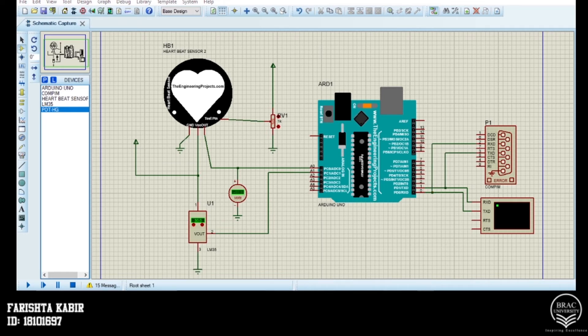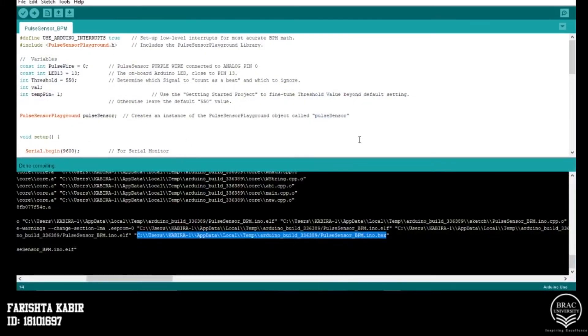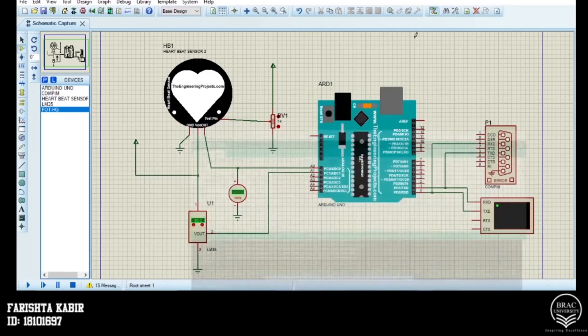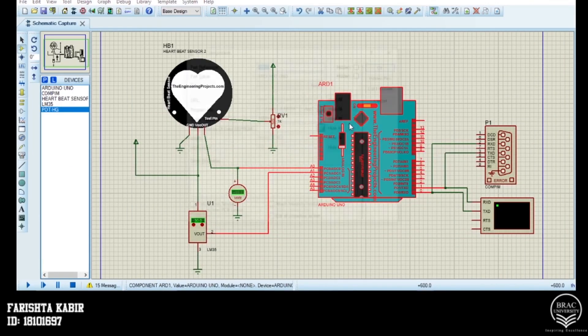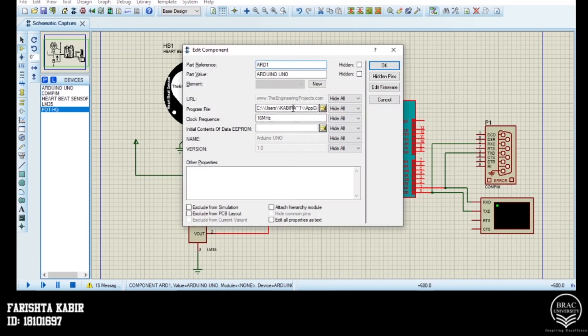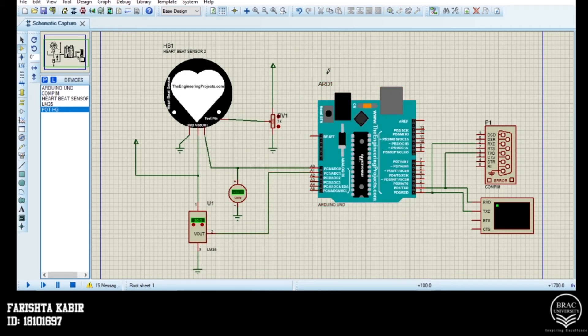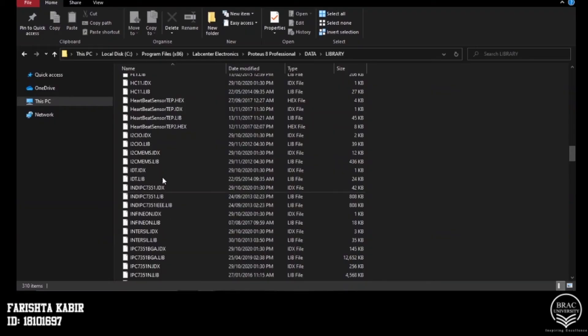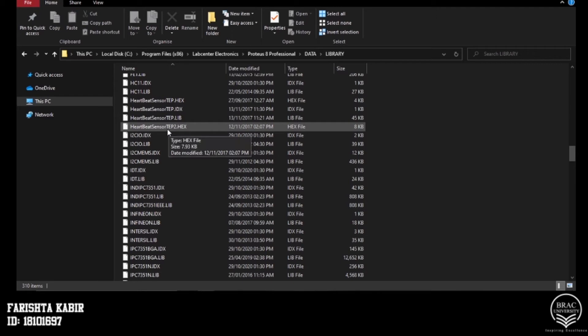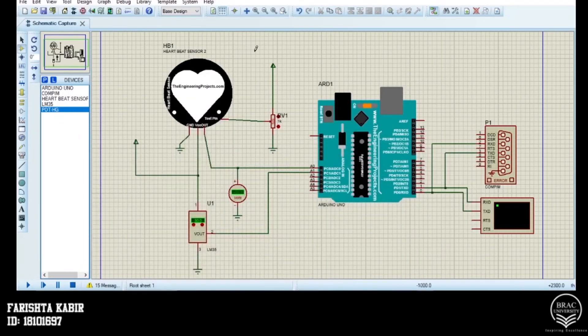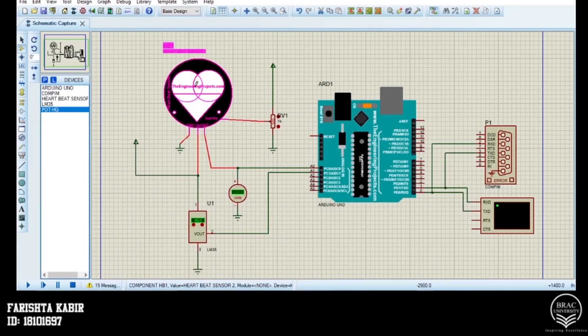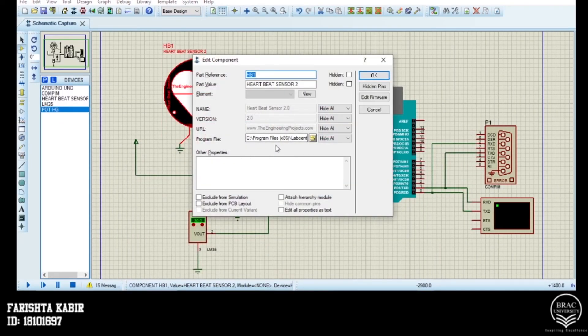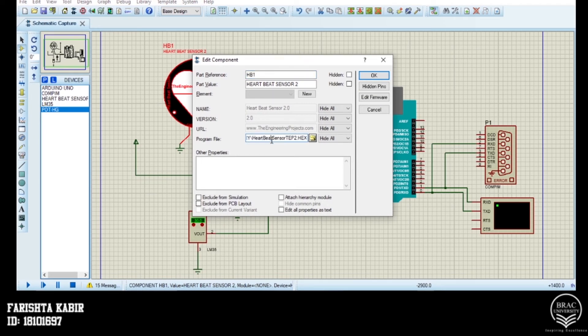We have our Arduino code already compiled and this is the code's hex file path, which we will load into the microcontroller by copy pasting. So this is the path that has been loaded. And after that, we will load the hex file of the heartbeat sensor from our Proteus library and we will load the path into our heartbeat sensor. And this is the path of the heartbeat sensor's hex file.